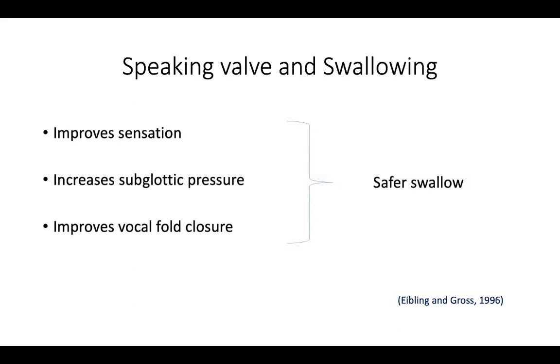It really depends on the patient. Once I put the speaking valve on and the patient has clear voice, good cough, good throat clearing, and is able to clear their secretions, then I would assess him right away, because I know that he restored his upper airway functions quickly.